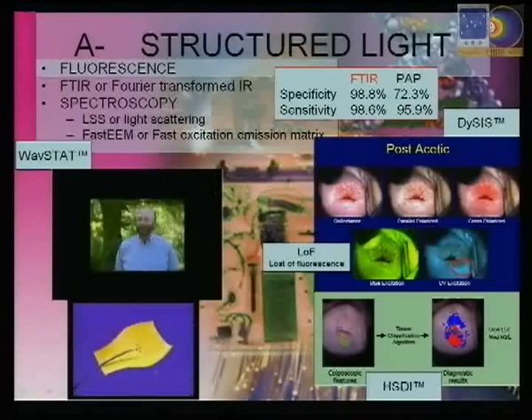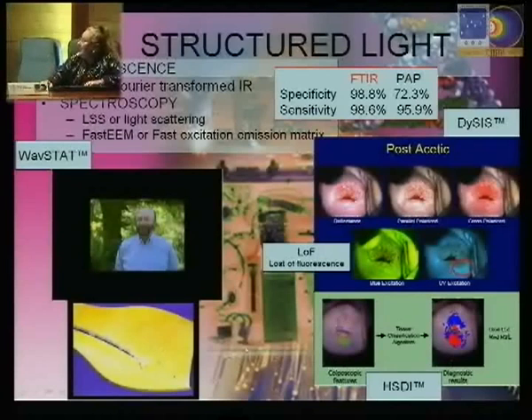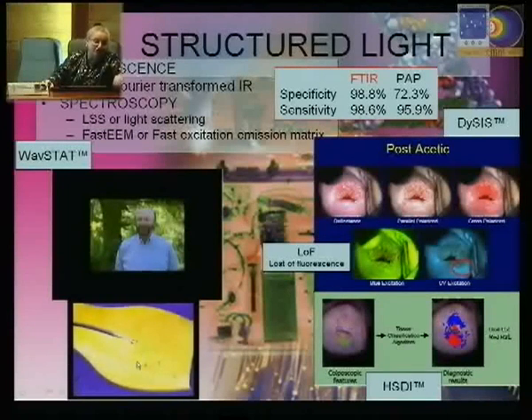The only thing you get in here are curves of the concentration of substances which are in the area, and those curves are interpreted as benign or malignant according to a training set that had been done in this system. This means that you do a colonoscopy, and immediately you detect if that polyp or any area is suspicious or not. You take the suspicious ones and you can leave the rest of the items which are not so suspicious.